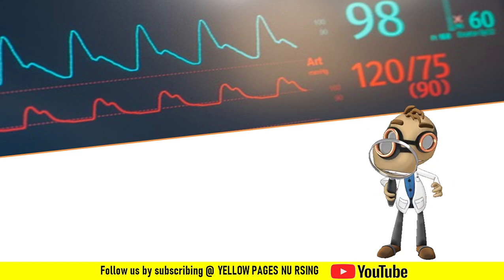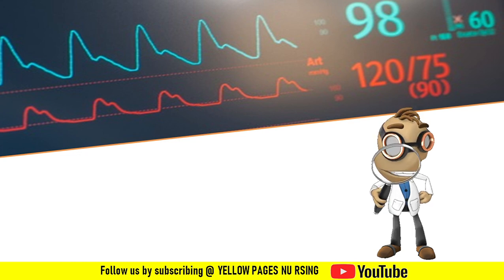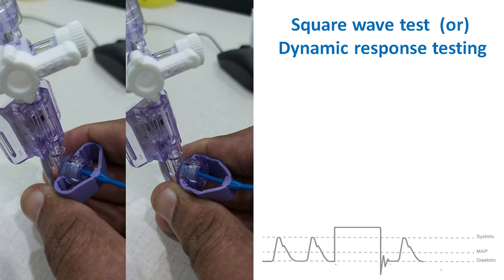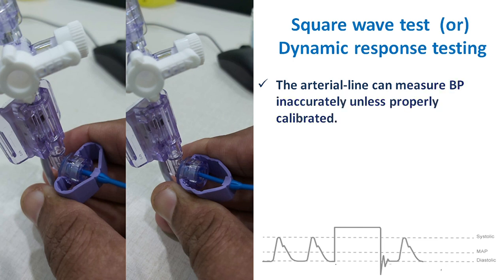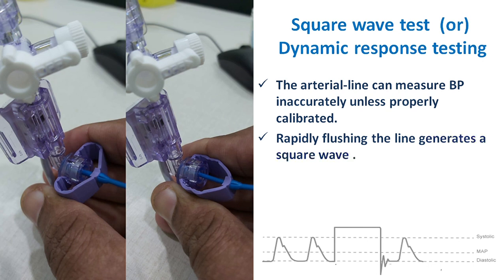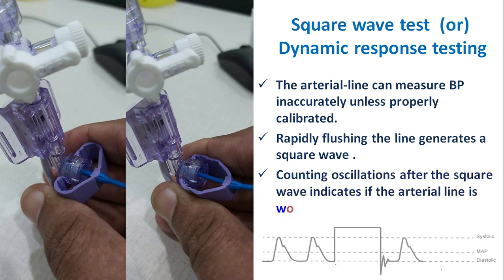The red waveform on the monitor shows the arterial line waves. Next comes the square wave test, also known as dynamic response testing. This is done because the arterial line can measure BP inaccurately unless properly calibrated. Rapidly flushing the line generates a square wave, and counting oscillations after the square wave indicates if the arterial line is working properly. This is performed once per shift to enhance accuracy.